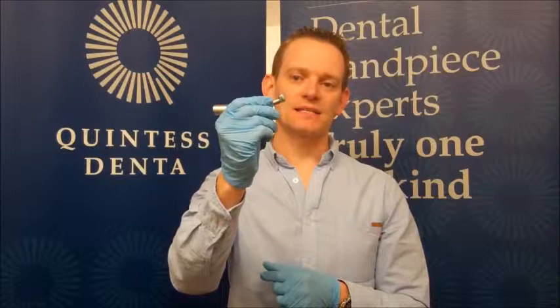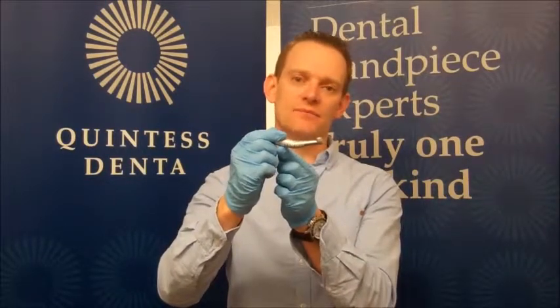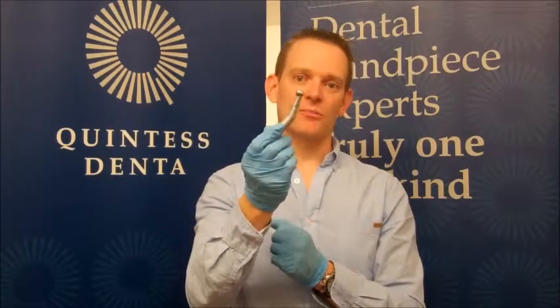The first thing to bear in mind when handling the handpiece is that you don't drop it. If it's dropped, not only can you break the very fragile optic rod in here, you can also damage the head. If the head is dented, sometimes it can be beyond repair and that makes the handpiece worthless basically.